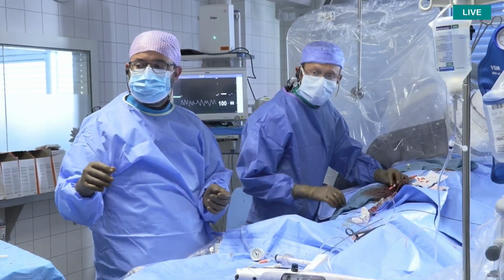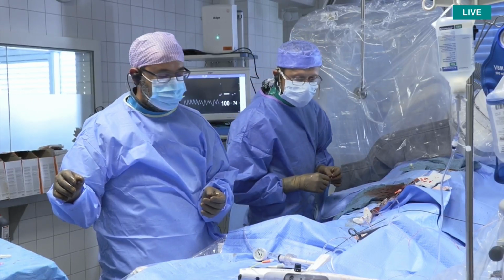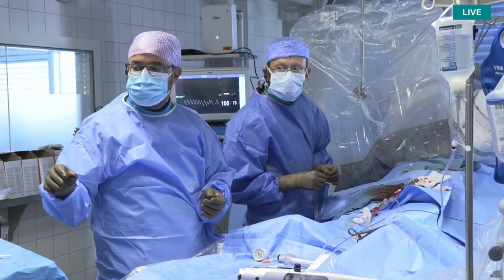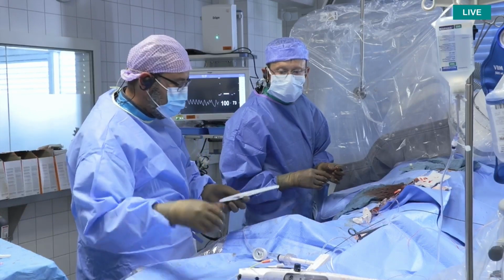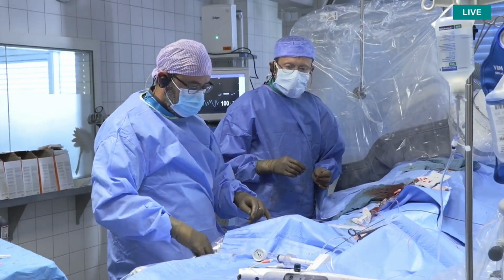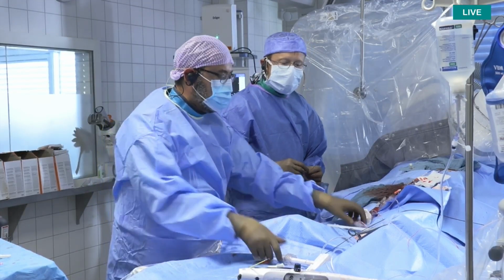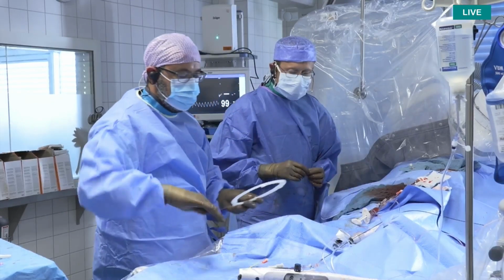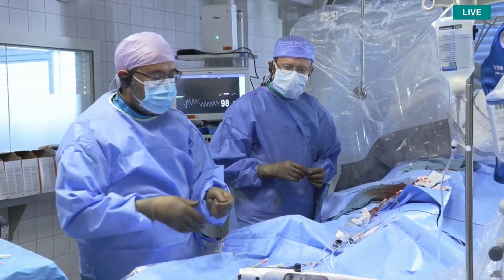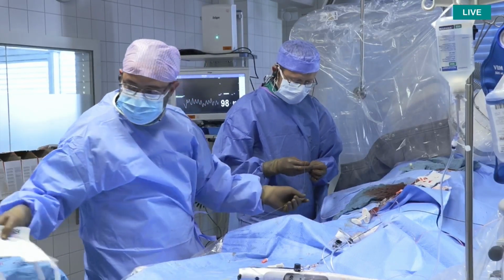Are you still with us? Yes, I was curious because the angiographic aspect of the left main lesion resembled a bit a calcified nodule. And the 2.5 balloon may be too small for you to fully appreciate whether you're expanding well or not. Yes. That's where I would think the IVUS would be very helpful. Yeah, and this is why, also at the LAD ostium, taking the 2.5, the still bigger balloon has some constriction there anyway.